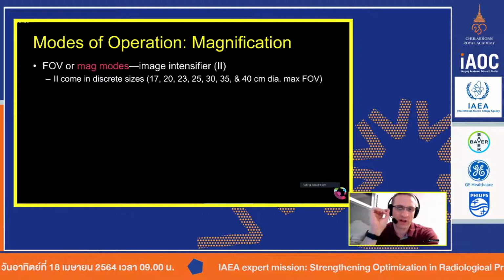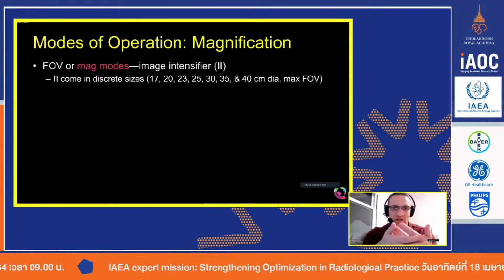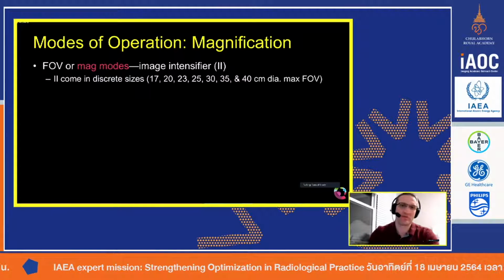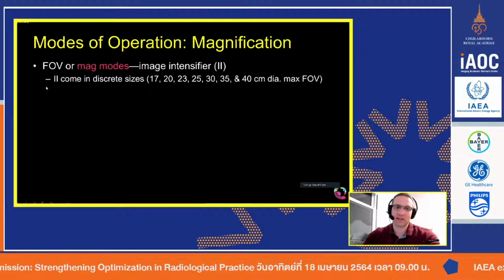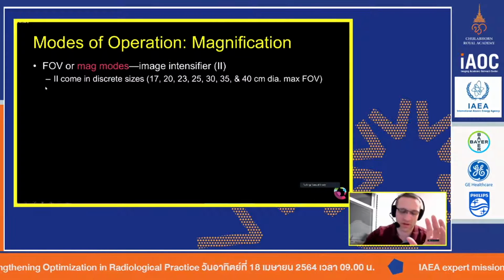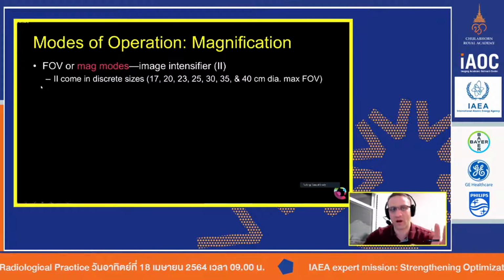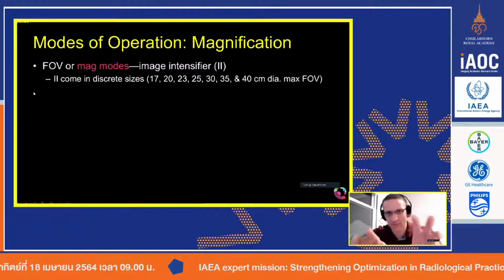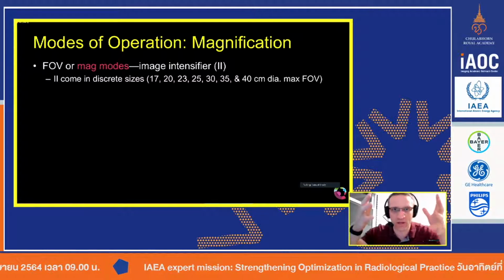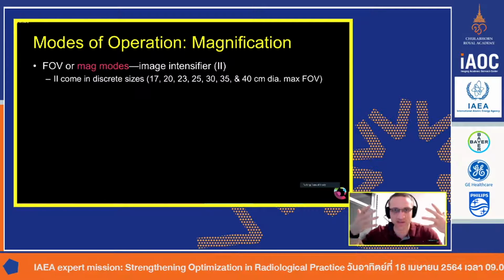We talked a lot about controlling the noise, so collimating, using grids, or if in some future day we have some fancy reconstruction technique. The next step down along the list of image quality optimization is how we operate the system. Remember, no kV knob, no mA knob, so it's all about how we actually use the system to then affect how our eyes see the image.